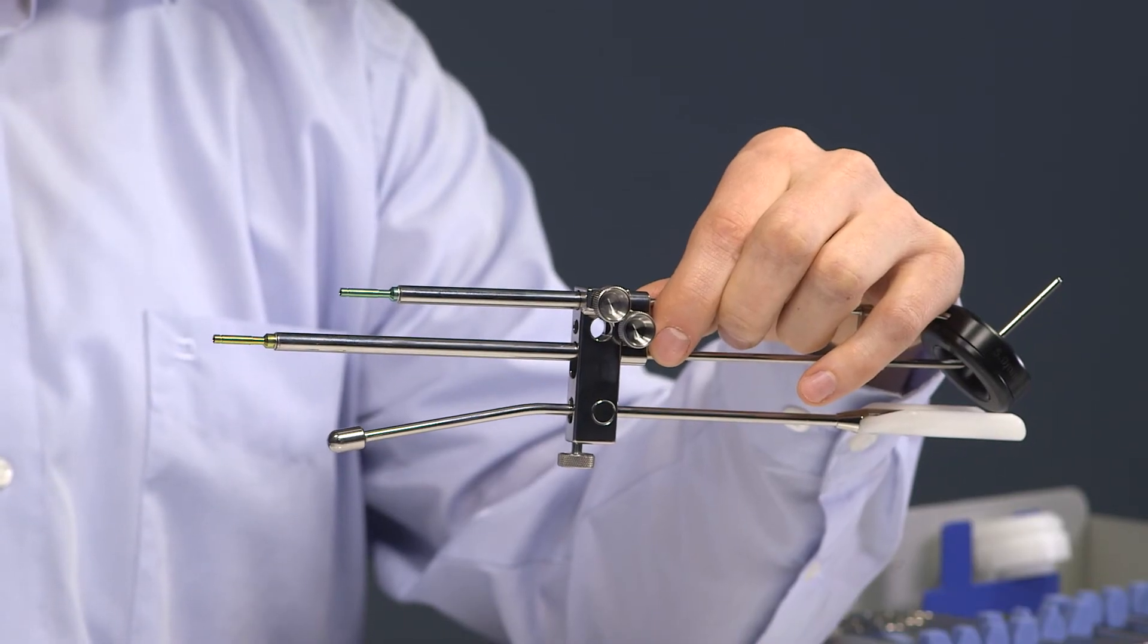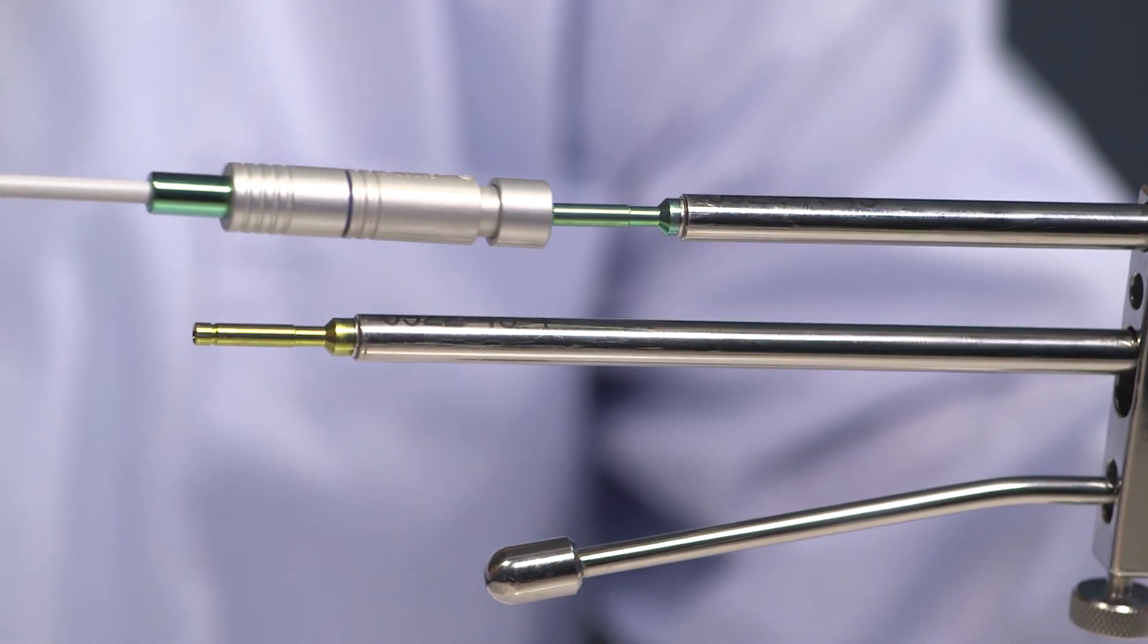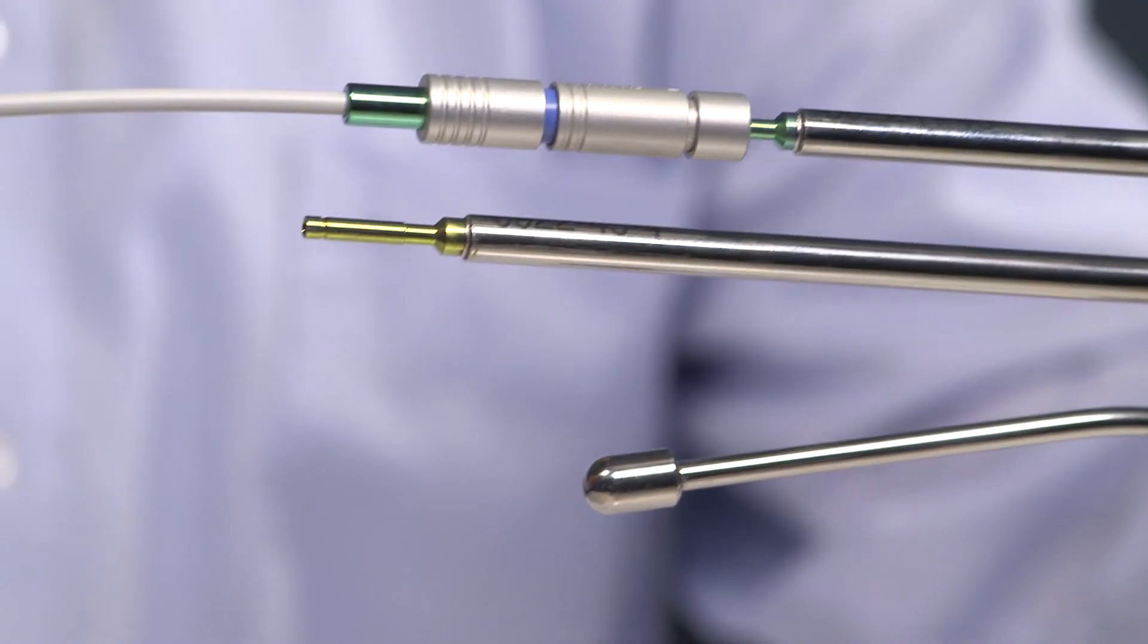In order to start the treatment, transfer tubes are needed. Eckert & Ziegler-BEBIG provides color-coded transfer tubes that are connected like this.